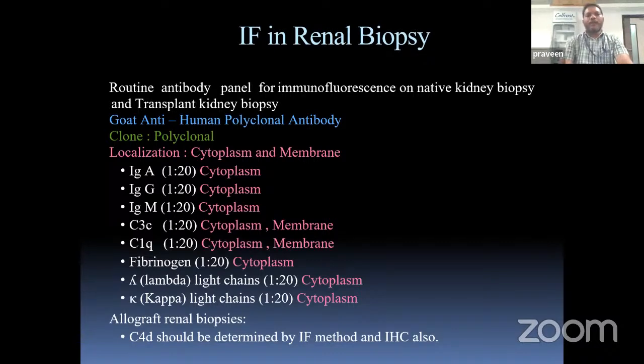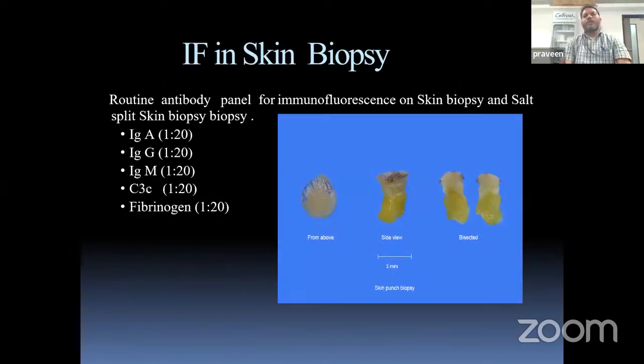We are using that renal biopsy, and we are staining grafted renal biopsy also. C4d can be determined by IF or IHC also. Immunofluorescence techniques can be performed on a skin biopsy also.